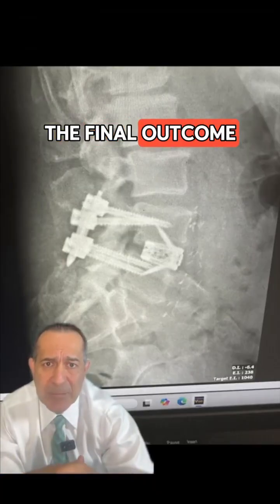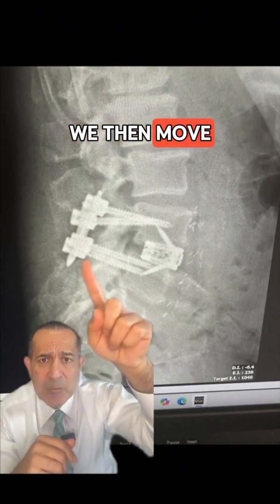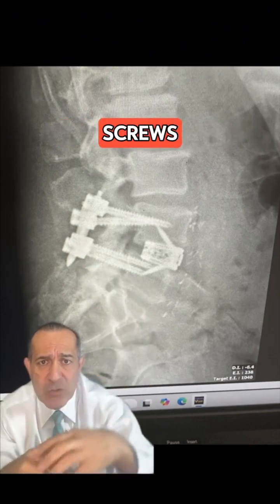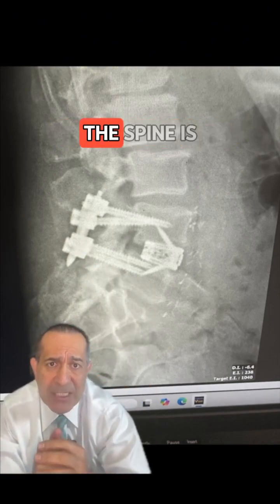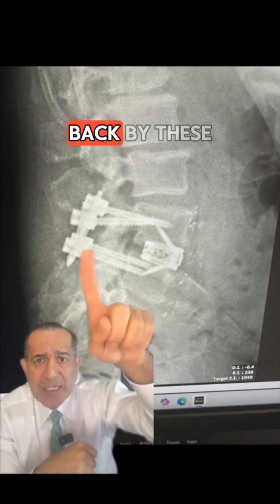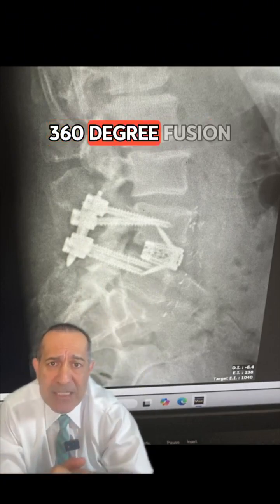And this is the final outcome. After the implant was placed from the front, we then move the patient to the back, turn them around, made an incision, and put these pedicle screws. In this fashion, the spine is held from the front by this cage and from the back by these pedicle screws — and this is what's called a 360-degree fusion.